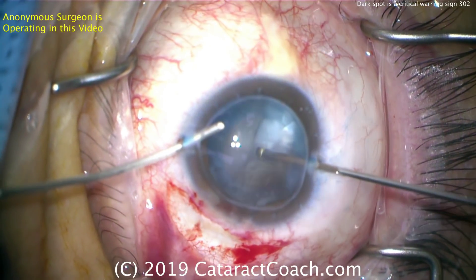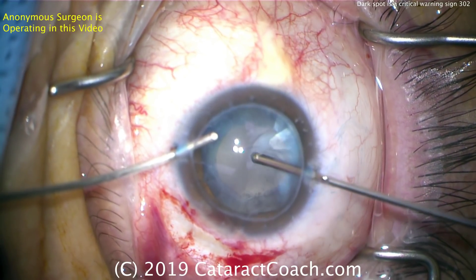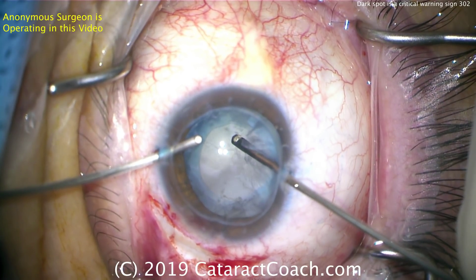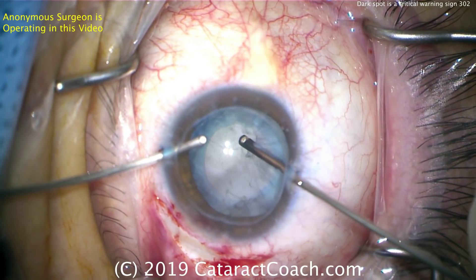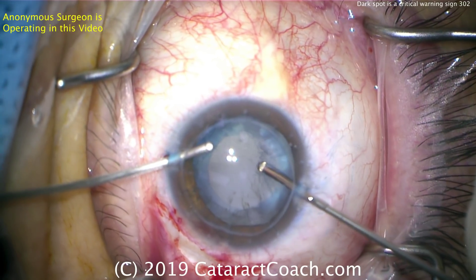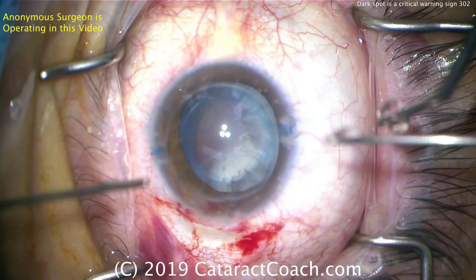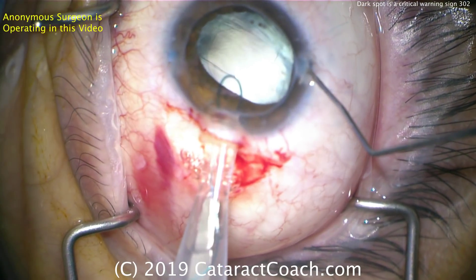I do applaud the surgeon for that — that's a good move, a nice conservative approach. Cleaning out as best we can all the material from the anterior segment. We've already talked about in previous lectures how to do anterior vitrectomy, how to differentiate between the two different settings of I/A cut versus anterior vitrectomy. In this situation we're trying to remove prolapsed vitreous, so we want the anterior vitrectomy mode — probably a very high cut rate, at least a few thousand cuts a minute, relatively modest flow, and a moderate degree of vacuum. In anterior vitrectomy mode, remember we don't engage vacuum until after the cutter is already moving. Switching hands — that's a good maneuver here as well.